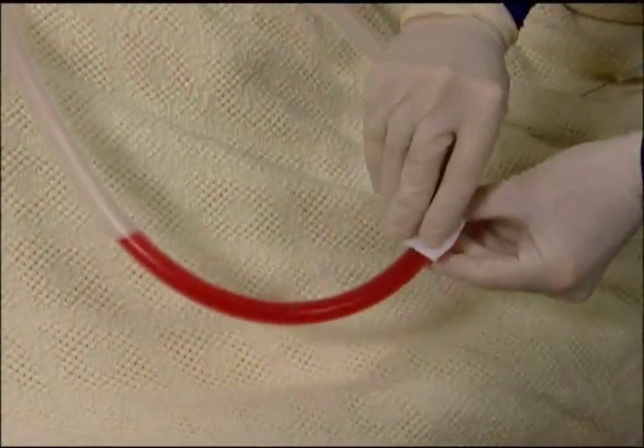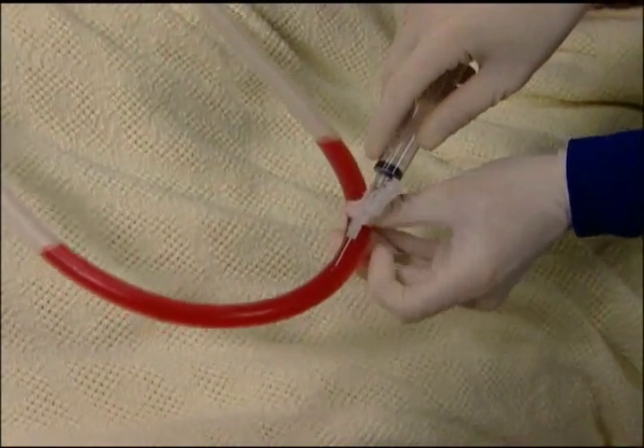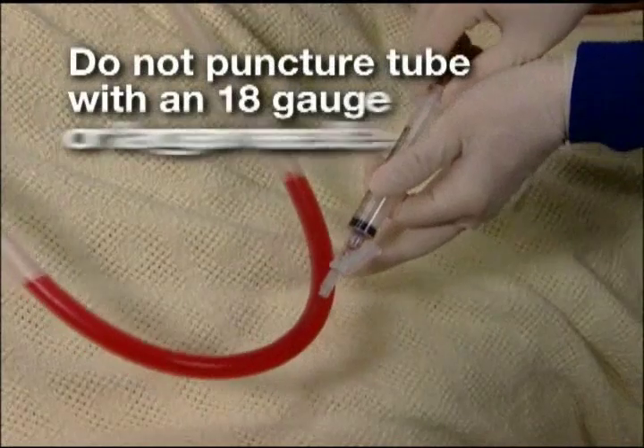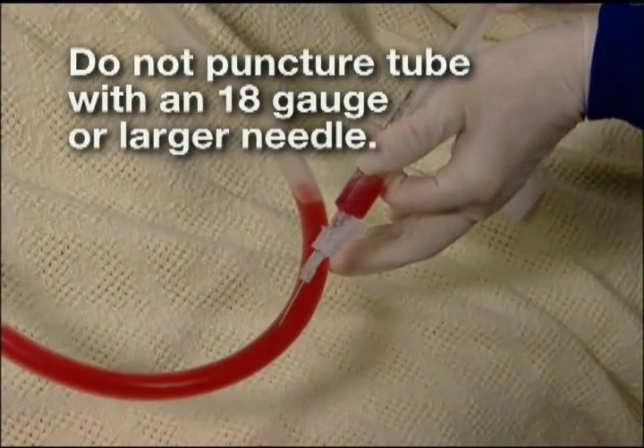Depending upon your hospital's preferred sampling technique, samples of drainage fluid can be taken directly from the patient tube by forming a temporary dependent loop and inserting a 20 gauge or smaller needle with syringe at a shallow angle.